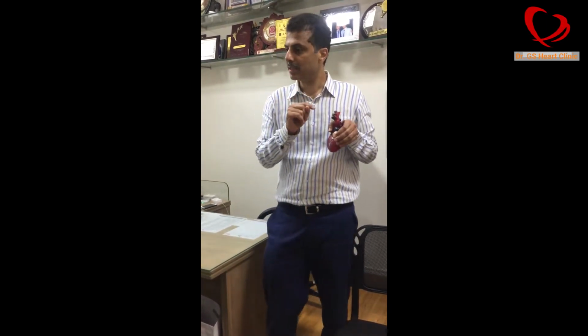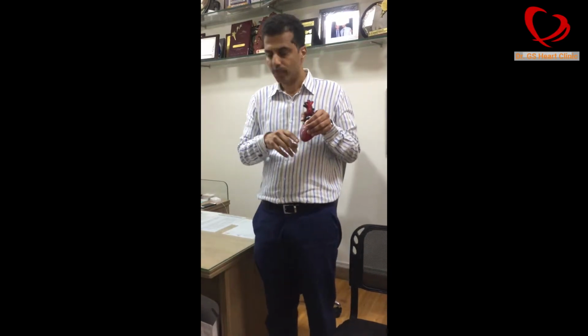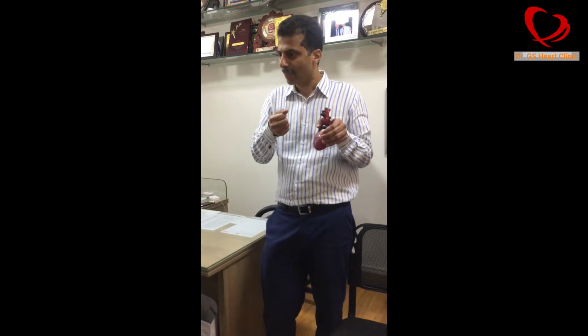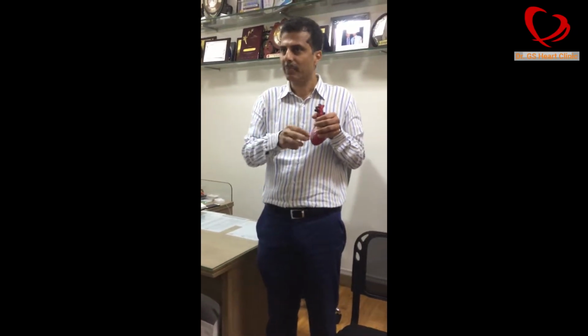But the problem with OCT is the light will not pass through blood. So when you have blood going through the blood vessel, we cannot see the structure. So we have to remove the blood. How do we remove the blood? We inject dye, and for the few seconds when we inject dye, about 3 seconds, at that time we quickly image. The blood is not there, the contrast dye allows the light to pass. So in those 3 seconds, we get a complete imaging. That is OCT. Now I'm going to show you the OCT.